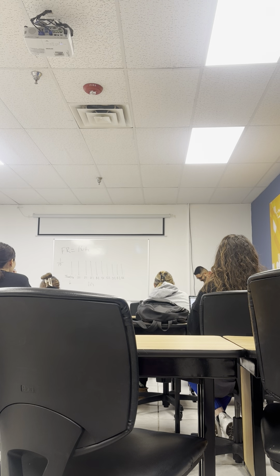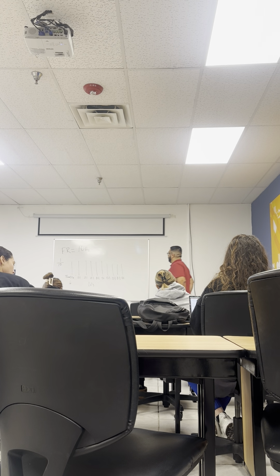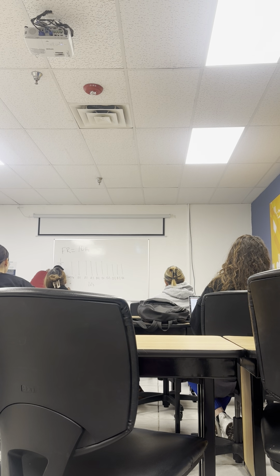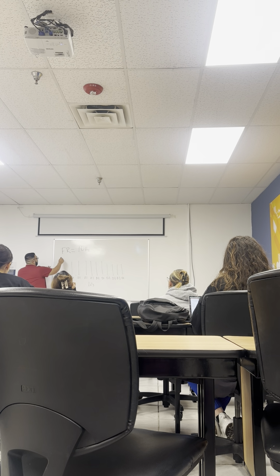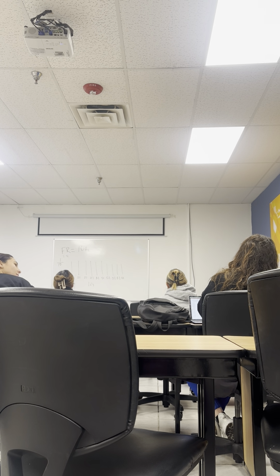Hold on. One over, you said 2.0 or 0.2? Okay, I think it is 2.0. So if our T frame is 0.2 seconds, what's that frame rate? What's the reciprocal of 0.2? Or what's 0.2 in fraction?